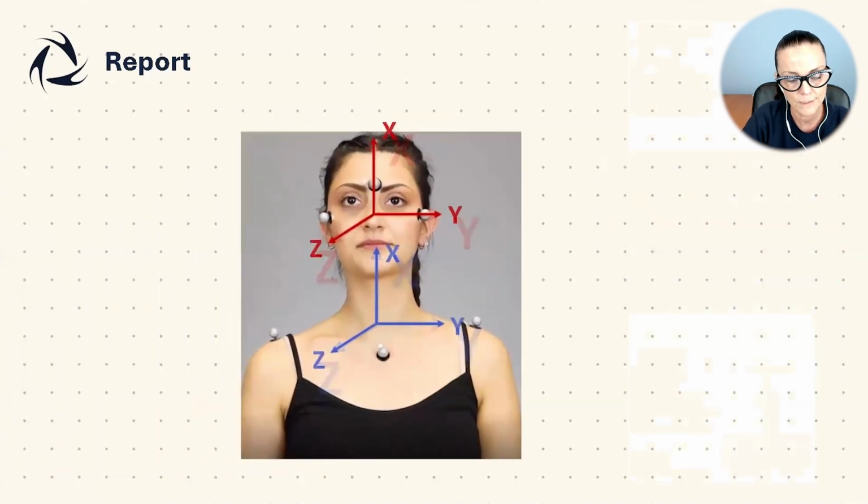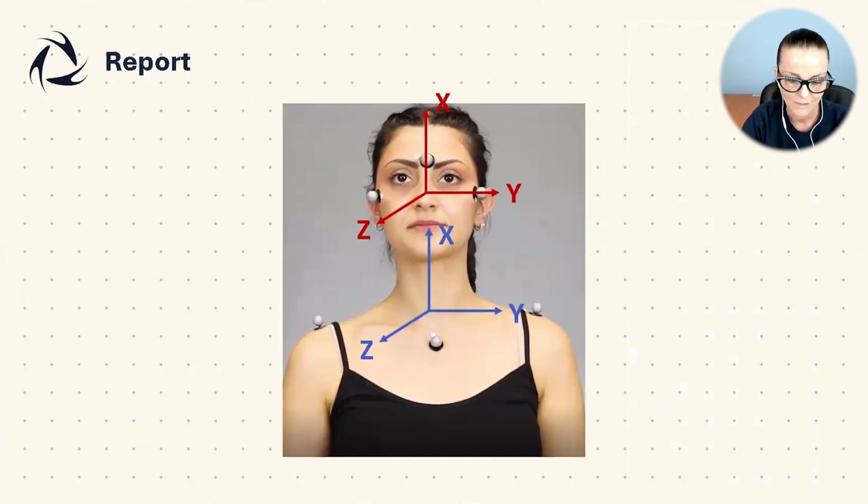Now, let me explain very quickly one basic biomechanical concept that is surely useful for who wants to develop a new computation protocol. When you are interested to assess the range of motion in terms of angular excursion of the joint, you have to take into account the two contiguous bone segments that form the joint.